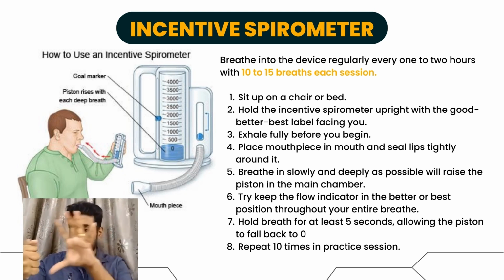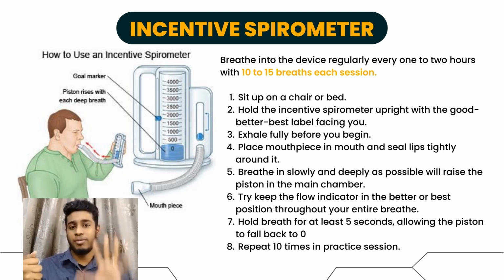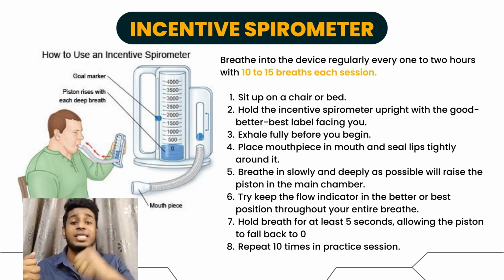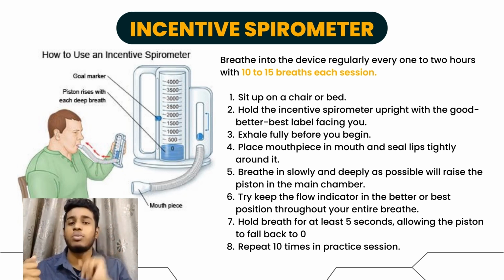The label must be facing you. You have to see the label. Then we have to exhale fully before you begin to use the spirometer. Then you should place the mouthpiece in your mouth and seal your lips tightly around the mouthpiece.